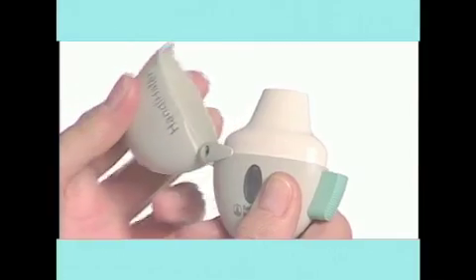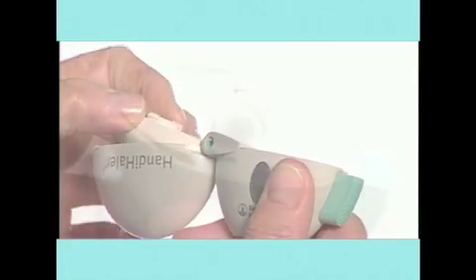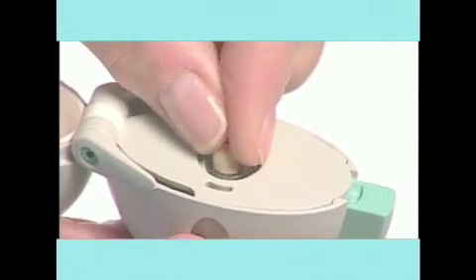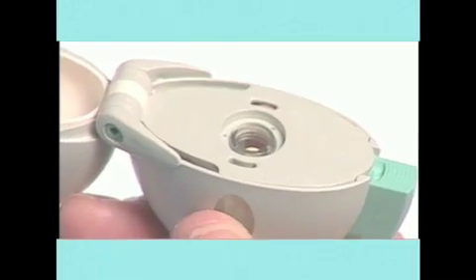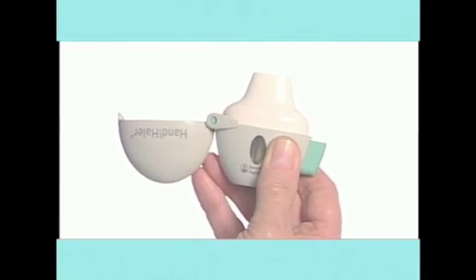Open the Handihaler lid by pulling the lid upwards, then lift up the mouthpiece. Drop the capsule into the capsule chamber — it doesn't matter which way the capsule is placed in the chamber. Close the mouthpiece firmly until you hear a click, but leave the lid open.